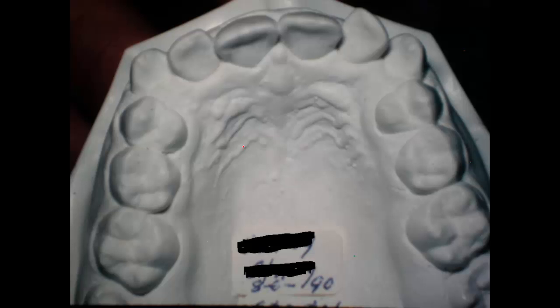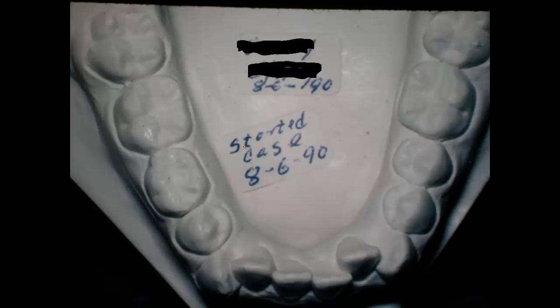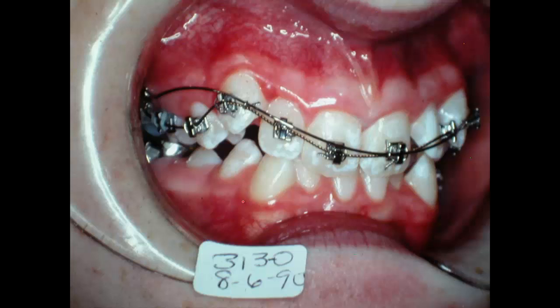We actually took the records a good time before we started the case. We started the case on August 6, 1990. I was doing this gratis for this pastor and his family — very fine people. This young lady was a very conscientious patient.